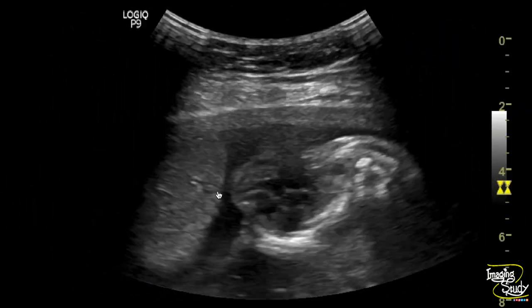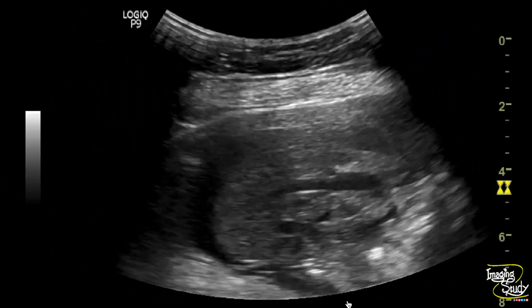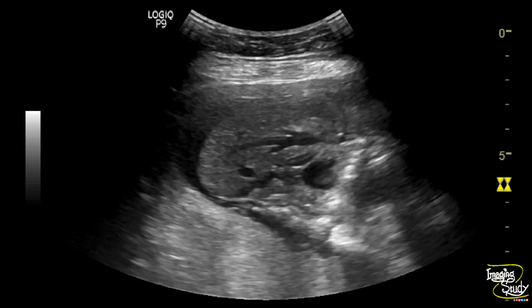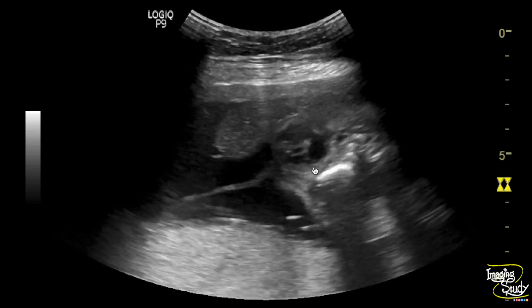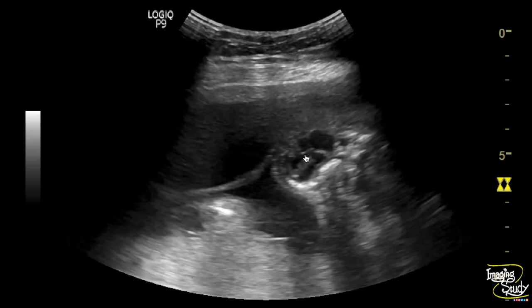Again, another view of the heart and the herniated liver. The heart contains a tiny interventricular septal defect at this point.